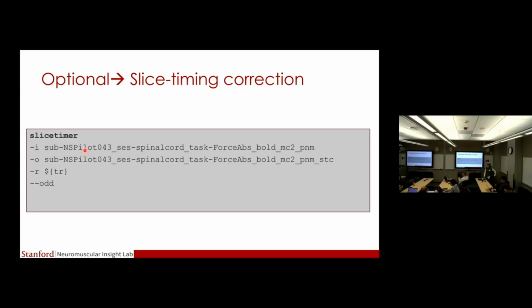But what would be the right way to do it? That's a really good question. I think one has to do a systematic comparison. But definitely this would be one of the wise ways to do it. If you are doing it, you should do it after PNM, in my opinion. But I also know from Ekhan's results that Dimitri's group actually does it before slice timing. I asked them about that, and they said they didn't see a lot of difference whether you do it pre-slice timing or after slice timing. It depends on your short TR.